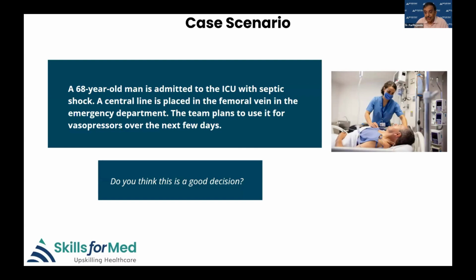No. We know by evidence that femoral lines cause CLABSI, and that should be removed as much as possible. So I know a lot of people have answered no, and it is true, right? So even though, in an emergency, whatever is accessible has been done, the sooner you remove it, you are going to reduce the CLABSI rate. Okay, so that is why this case scenario is important. Next slide.